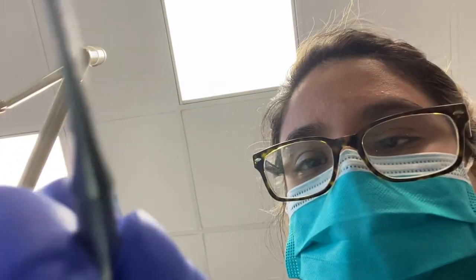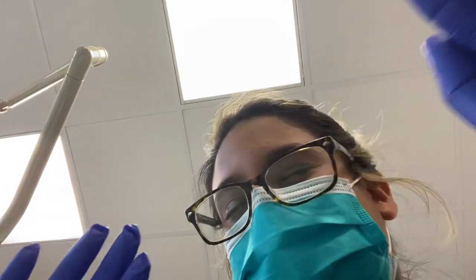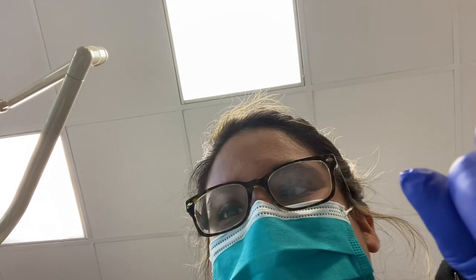And then let me just check, just to see if it's nice. Beautiful. Might polish around just a little bit. Not too much. Just a little bit — just needs a little polish. Awesome. All right. And just check around with your tongue. Does it feel all right? Perfect.